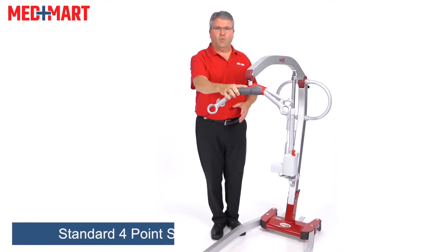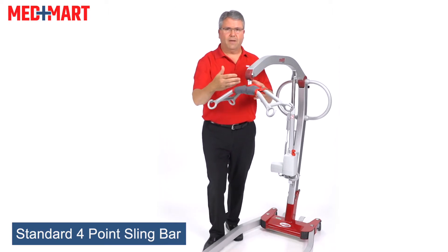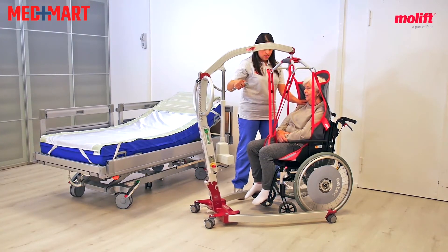One of the other things I like is the four-point sling bar. It's super easy to work with and it also has a little bit of padding. So if I'm bringing the lift in to my loved one, getting ready to get the sling in place, and they happen to move their head forward and bump this, that padding helps to minimize any chance of injury.